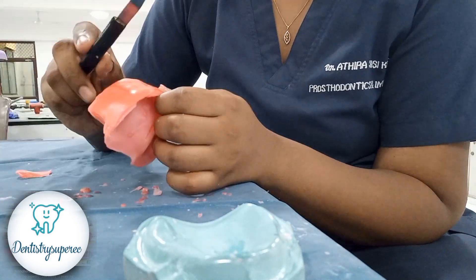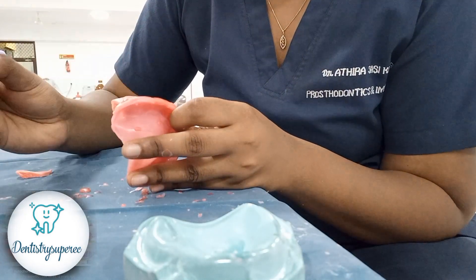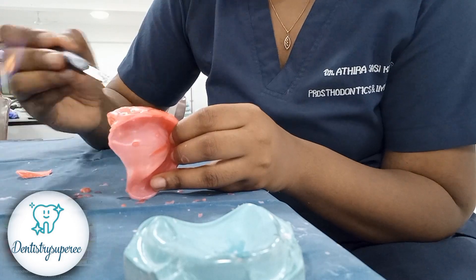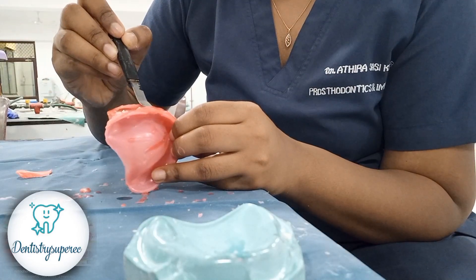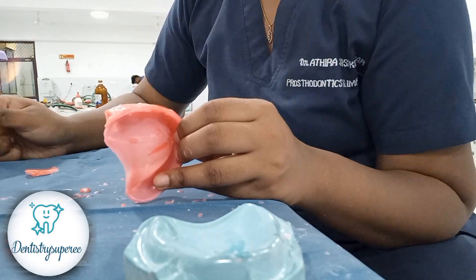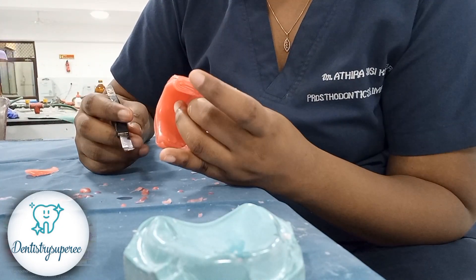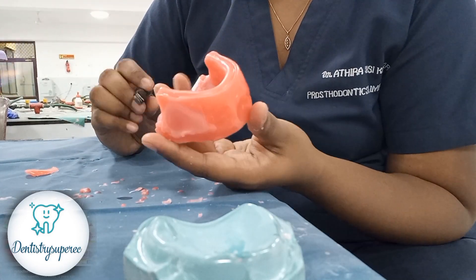There will definitely be air bubbles entrapped between the layers. What we do is heat the wax knife and slowly, increment by increment, melt the wax in that area. While melting, you can visually appreciate the air bubbles coming out. Section by section we melt the wax and wait — it gives such a smooth finish, eliminating all air bubbles. The entire rim will be done this way.